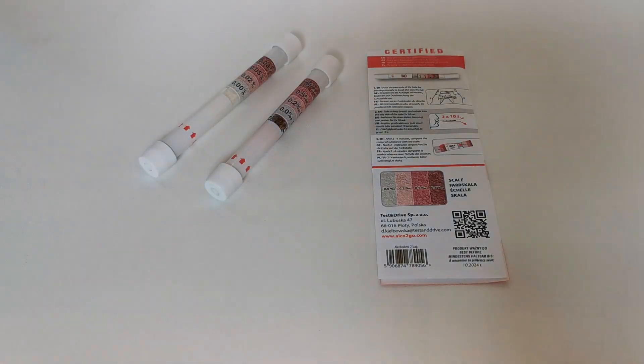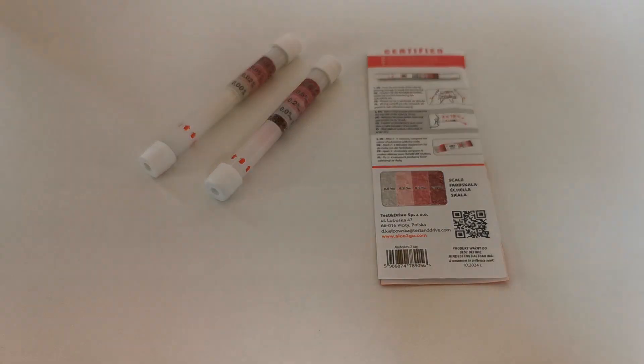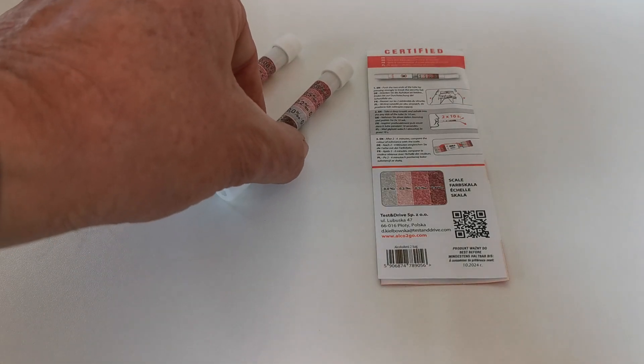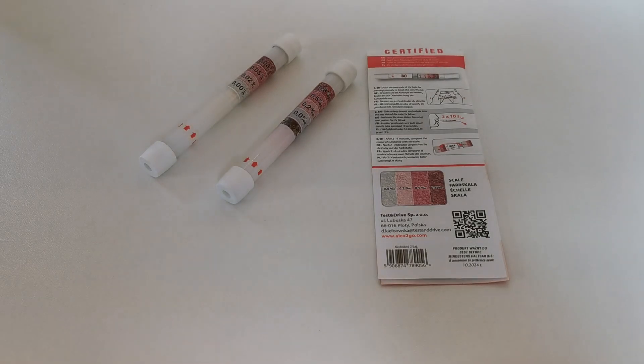I hope this video has been helpful in showing you how simple and easy these are to perform and interpret the results. After completion of the test, the glass breathalyser can be put in the normal domestic waste. No special requirements for clinical waste are required for this test.